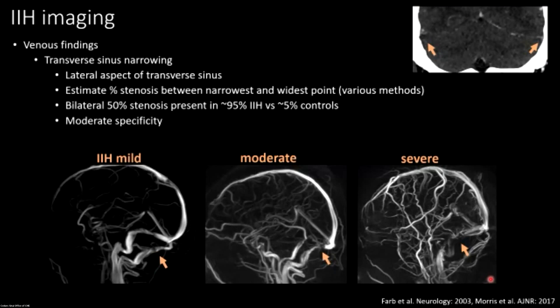Venous findings: transverse sinus narrowing refers to the lateral aspects of the transverse sinuses. On coronal CTV you just don't see the transverse sinuses — they smoothly taper down to slit-like things, and that's the stenosis we're looking for. I use the 50% rule: 95% of people with IIH will have 50% narrowing of the transverse sinuses at that lateral-most aspect compared to 5% of normal controls. I grade it as mild, moderate — getting pretty thin — and severe, where I kind of lose the vein in that segment.